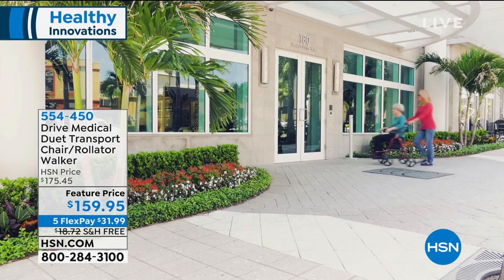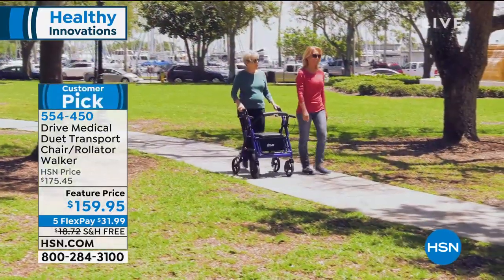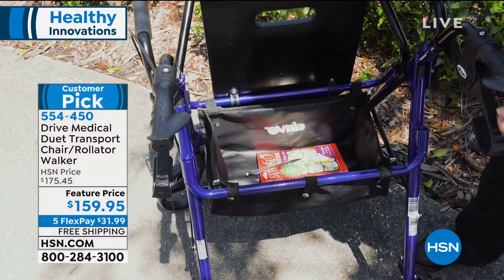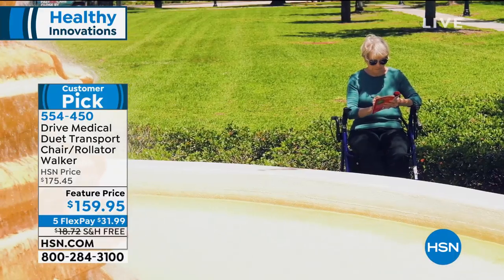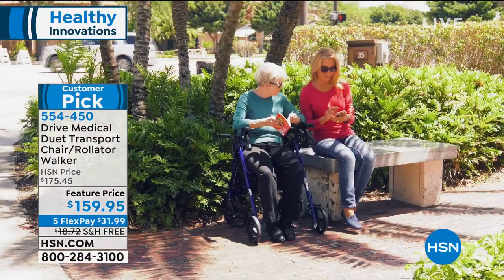Let's talk about the Drive Medical Duet Transport Chair slash Walker. This is everything you need in one — it is a transport chair, you can use it as a walker, and you can fold it up very easily to take it on the go. It glides so easily if someone is pushing you. It has a super comfortable seat, a nice backrest, storage, and it can hold a weight capacity up to 300 pounds.